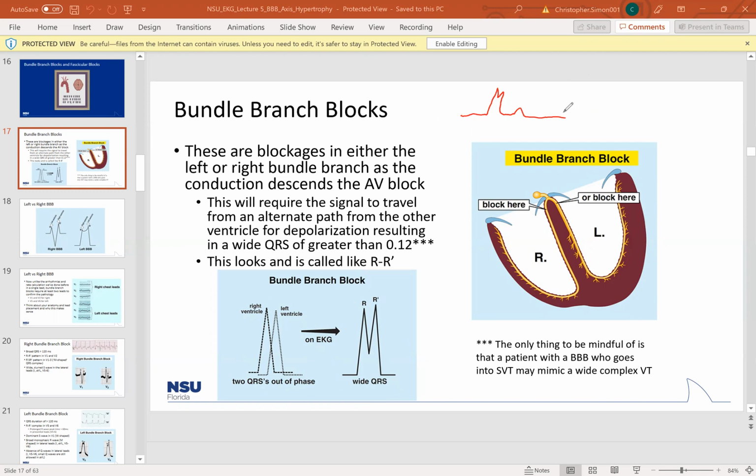And then a T wave, right? So why do I have a double R? Because that's an R wave and that's a second R wave, kind of looking like that, okay? What's happening here is that when you have a bundle branch block, for whatever reason, electricity is not conducting through that left or right bundle, and it's having to migrate through cell-to-cell transmission from the one side that it is traveling to the other side of the heart.